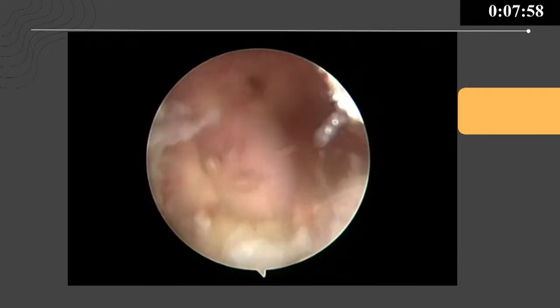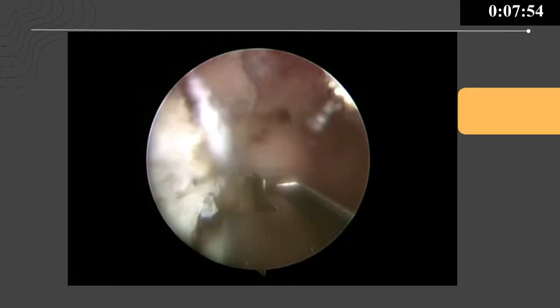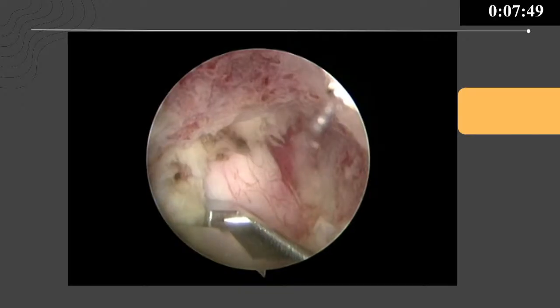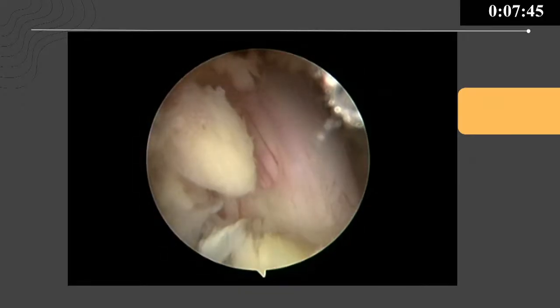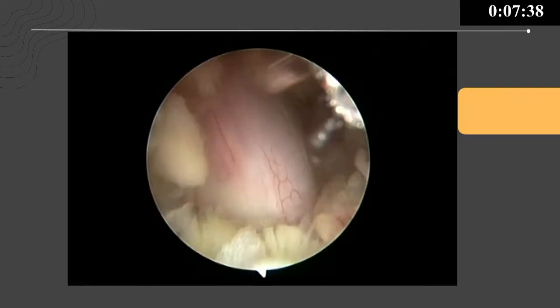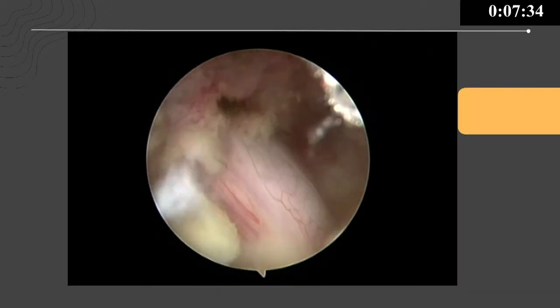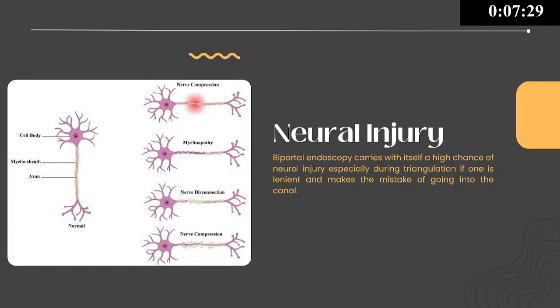60-year-old female who underwent an L4, L5 biportal decompression. If you would have appreciated earlier, there was some RF injury also. If you see the dura over here, this is lacking the capillaries. This was during the initial phase of my practice. And again, now unfortunately I have taken a fold of dura along in my Kerrison punch while removing the flavum also, and I did not realize it unless there was a dural tear.